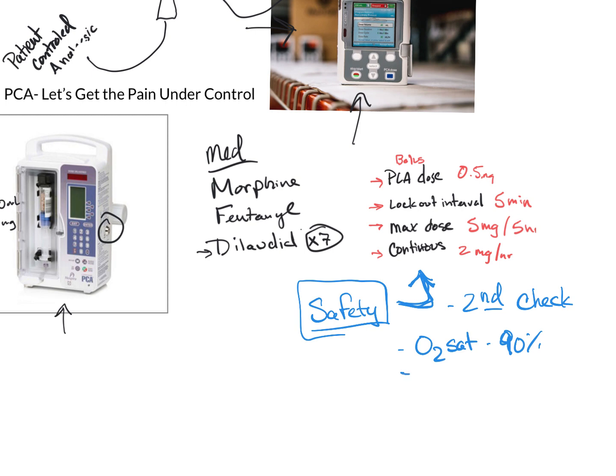New things we're seeing come around is end-tidal CO2, which is what your CO2 is at the end of air expiration. So if you're retaining that CO2, your acid is building. Now we're coming into a hypoventilative state, and then we're becoming acidotic. So we don't want that. That's bad. So you're going to see one of these two systems used, if not both of them.